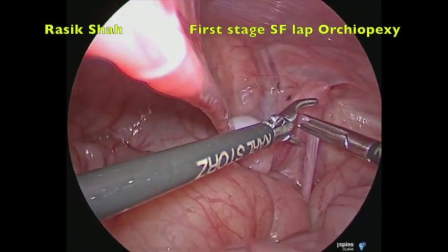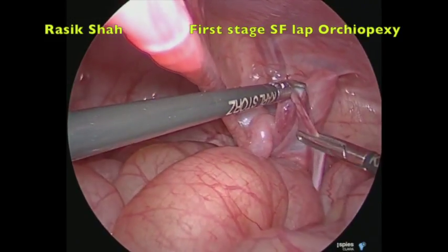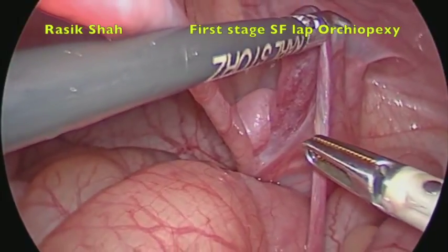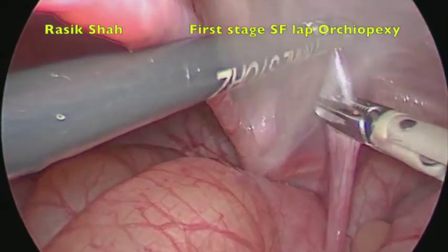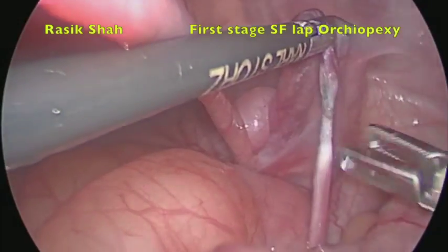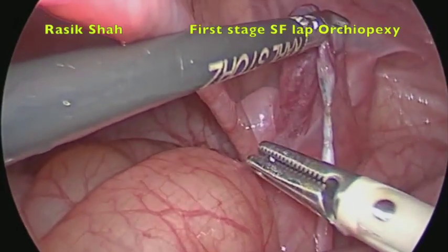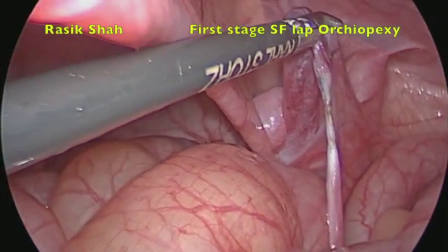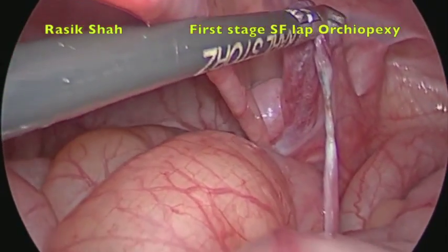We routinely use bipolar forceps which are 3 mm in size. However, one can use any other form of controlling the testicular vessels, which includes clips — for which you need a 5 mm port — a harmonic scalpel, or ligatures.